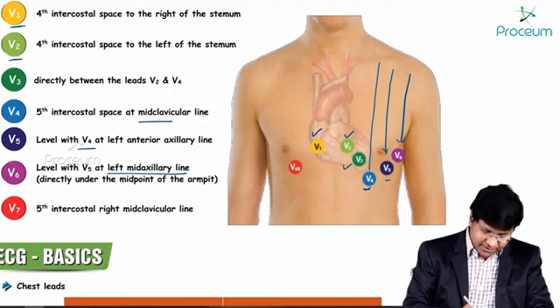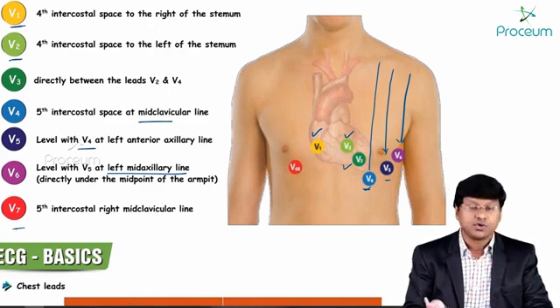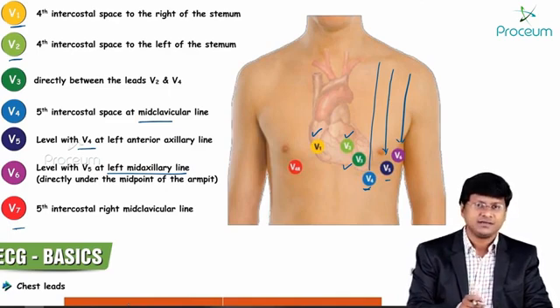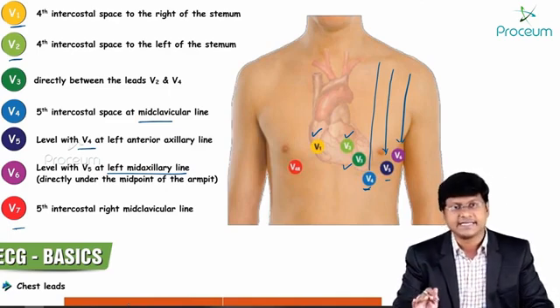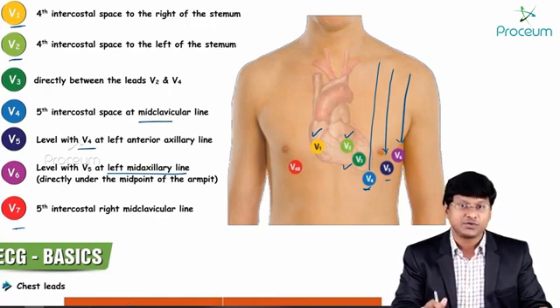And when do we place V7? V7, if the leads are placed on the right side. We will discuss that later. But now let me show you the same thing over the surface of the heart now.